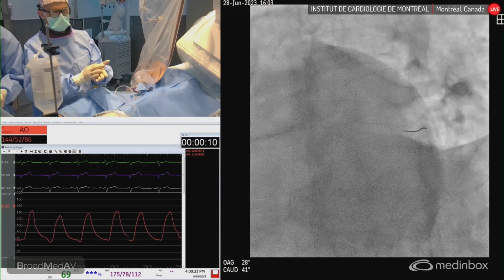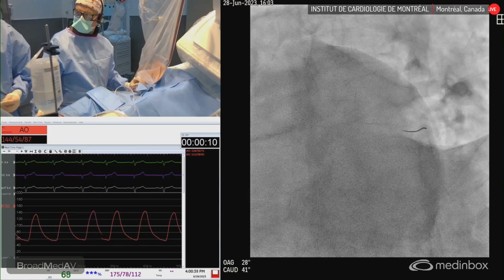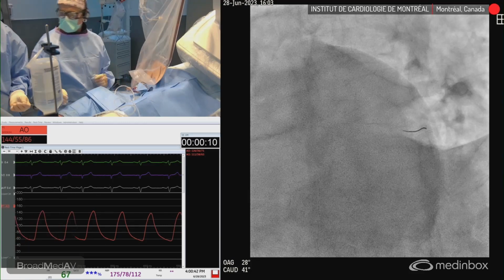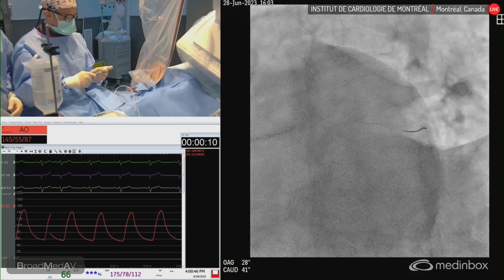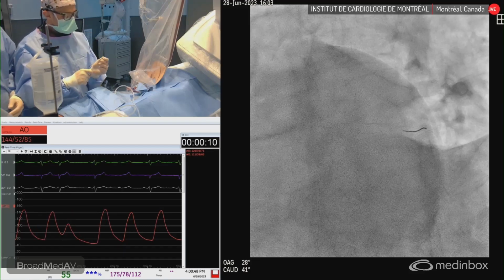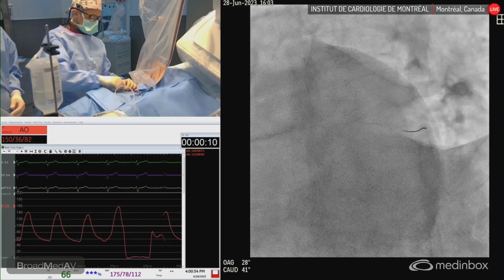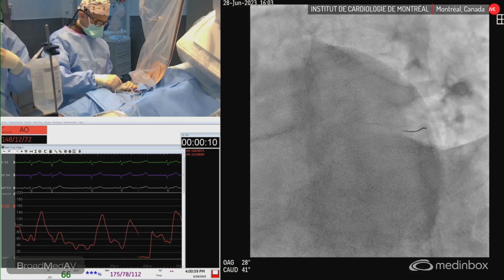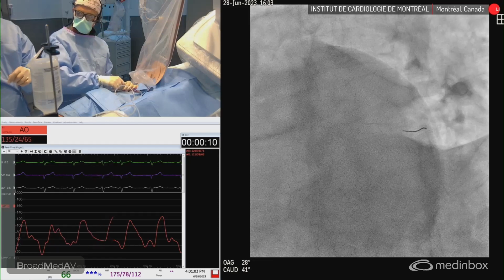Great. So everything is under control. Robert, you're doing great. We hope to get the kissing and the final IVUS in. That would be great. Kiss pot, and we'll finish by the pot, and then IVUS. I like to use the Sion Black for rewiring, or Pilot 50, just because it has a hydrophilic tip. It's better able to navigate the stent struts.